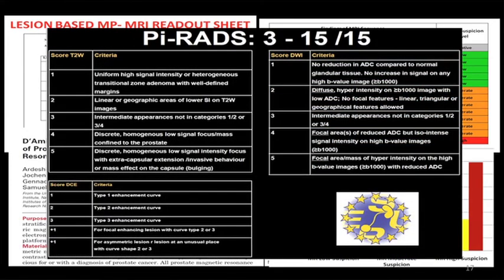In the meantime, we are aware of PI-RADS, which came from ESUR. We were a part of that PI-RADS system, and it is being evaluated by American College of Radiology. It's a really important thing. It will help us to talk the same language. So we are represented as NCI in DCE-MRI and T2 weighted committees of the PI-RADS. So this is still under work. I mean, it needs some work to be implemented to the U.S. system, but it's something promising.